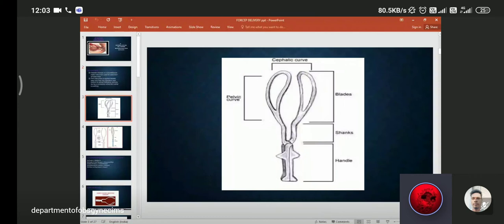This is the structure of forceps. You can come and see it is available in our department. It has a handle, then shaft and blade, and it has got two curves. One is cephalic curve that is inside of the blade, and the pelvic curve that is outside of the blade. The cephalic curve is around the fetal head and pelvic curve lies in the pelvis of the mother.